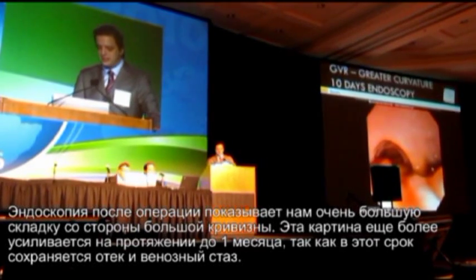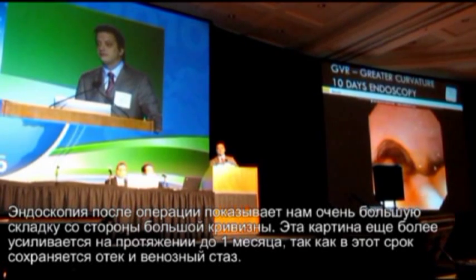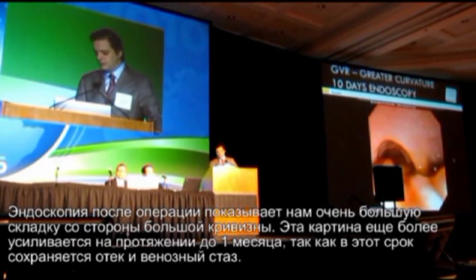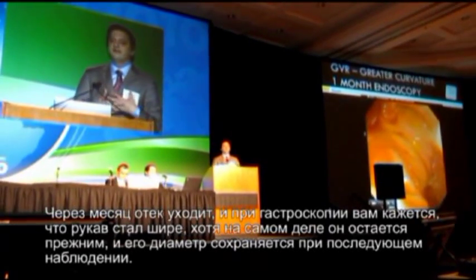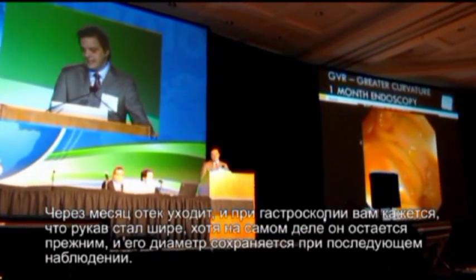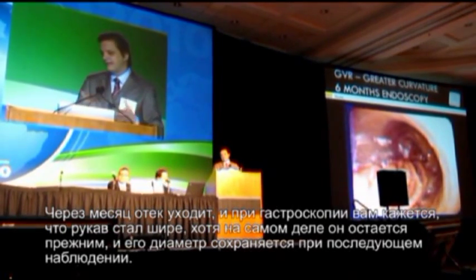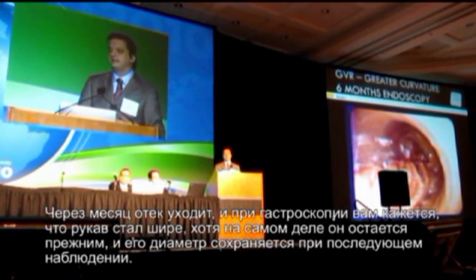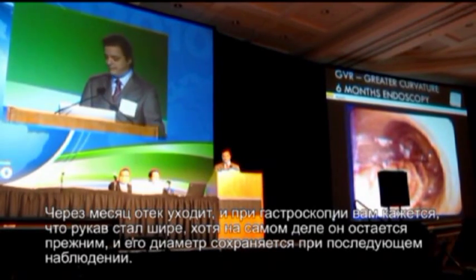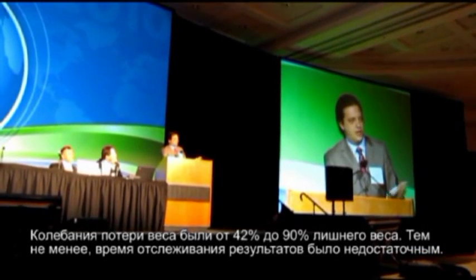Endoscopy shows us a very big fold of the greater curvature. I'll drive you through it here. This is the lesser curvature, my arrow. This is the greater curvature, anterior wall, posterior wall. This is the endoscopy at 10 days, and expect even worse up to 1 month, because there is a lot of edema and venous stasis. Just after 1 month, it dries out. I don't know if that's the exact term in English, but the edema goes, and you have the impression that your sleeve is dilated, but it's not. It's the shape that you're going to have up to the later total weight loss.